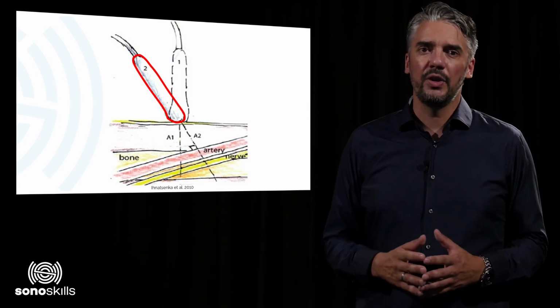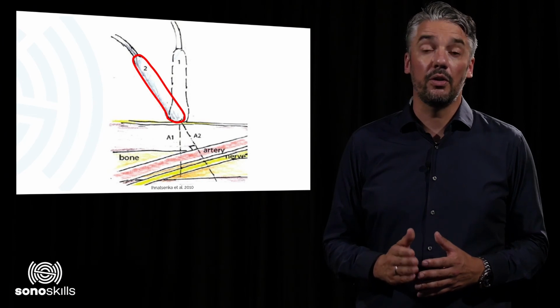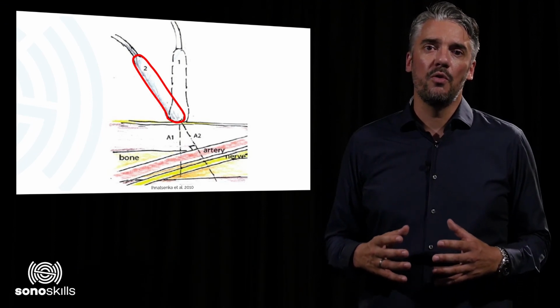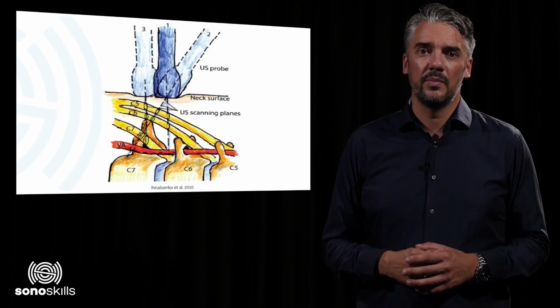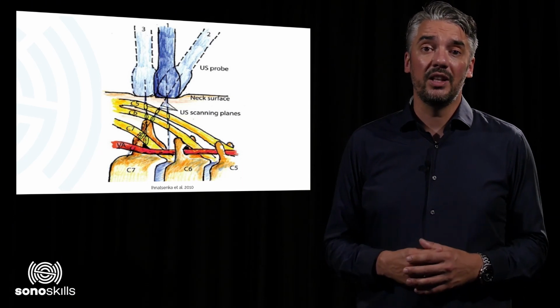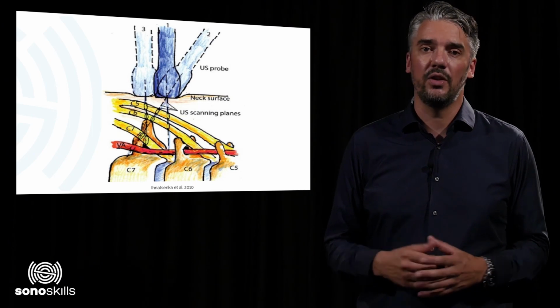Always search for the highest possible echogenicity of an anatomical structure or tissue. If the echogenicity is maximal, only then you know for sure that you're scanning perpendicularly. Following a certain structure or tissue over a longer stretch results in constantly adapting the transducer angle to the new location.